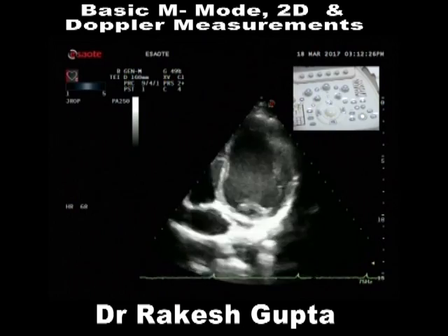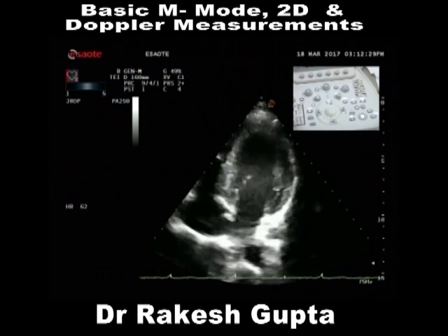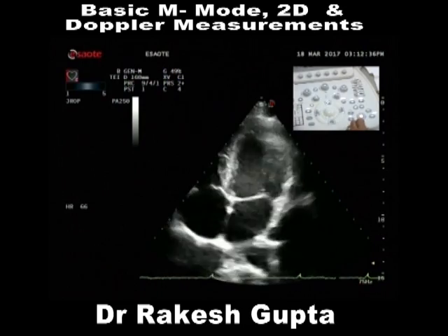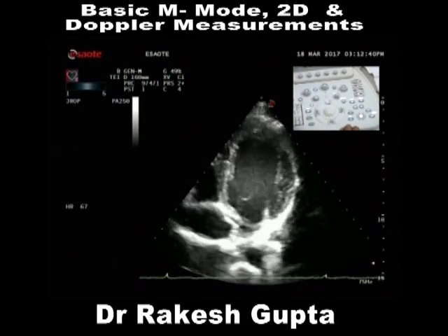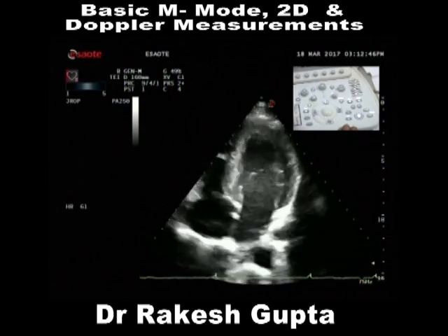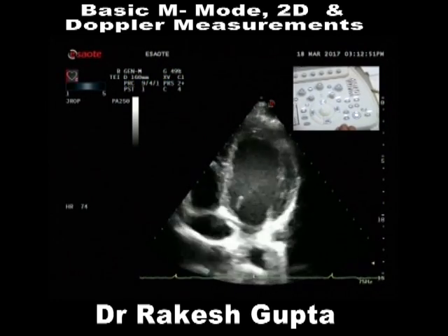At this point, many of you who are doing echocardiography must be feeling pressure about how to get a good endocardial delineation. Correct? So just manipulate your probe and ask the patient to hold his breath in end expiration or inspiration. Here we are not measuring velocities. Now what exactly happens with this patient?